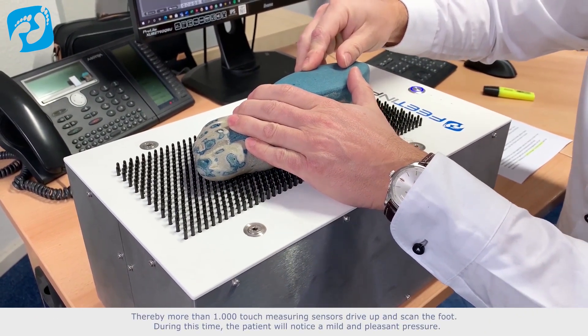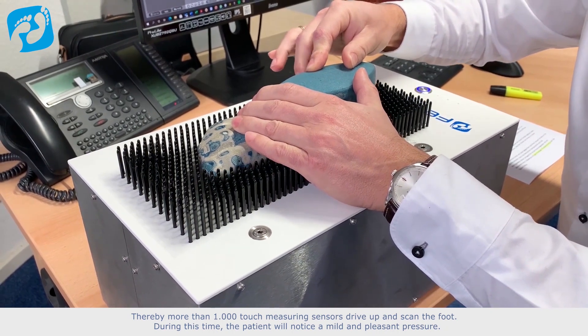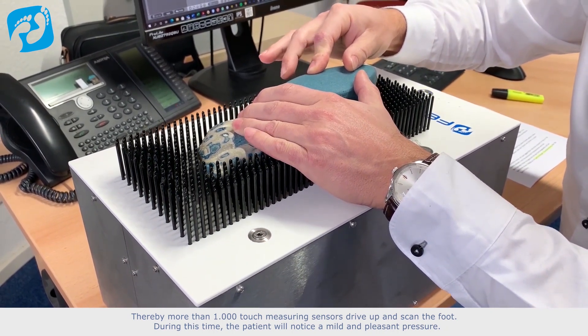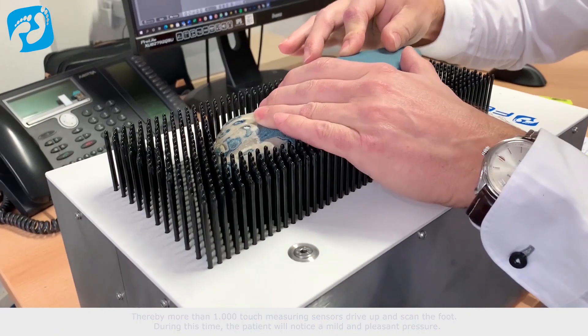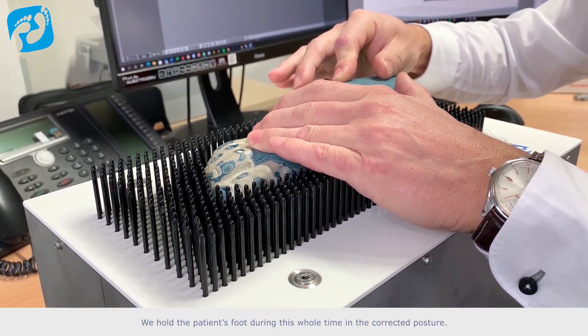Thereby, more than 1,000 touch measuring sensors drive up and scan the foot. During this time, the patient will notice a mild and pleasant pressure. We hold the patient's foot during this whole time in the corrected posture.